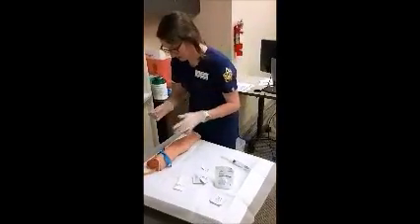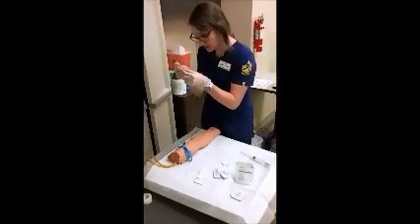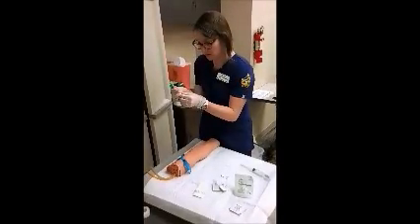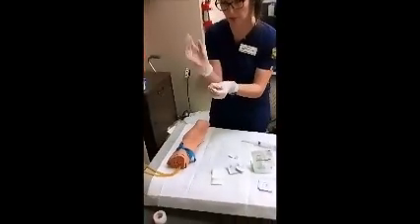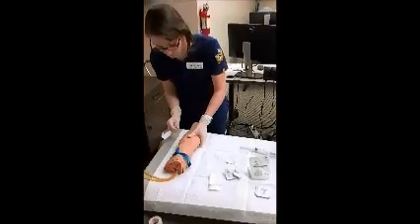Okay, now our patient is ready here. We'll pull that off. We're going to locate, make sure the hub is loose. There we go. Okay, we're going to locate the bevel on this, make sure that the bevel is pointing up. We'll stabilize the vein, just like so.